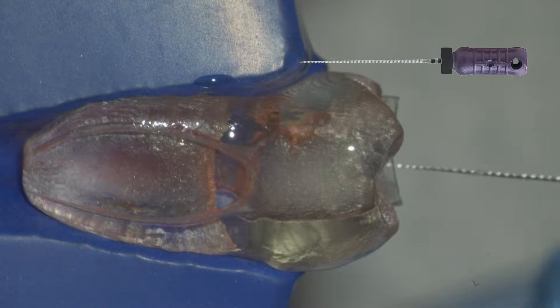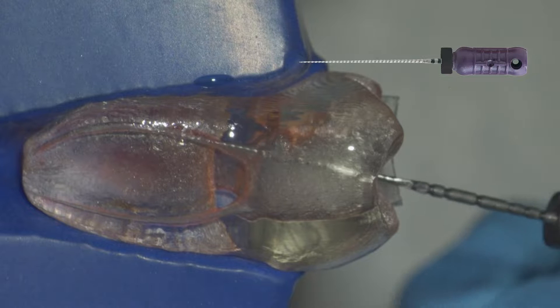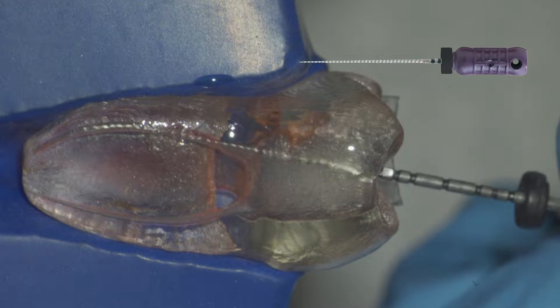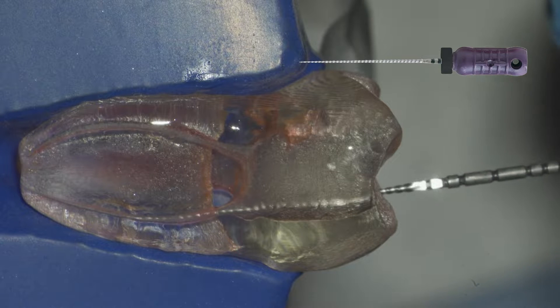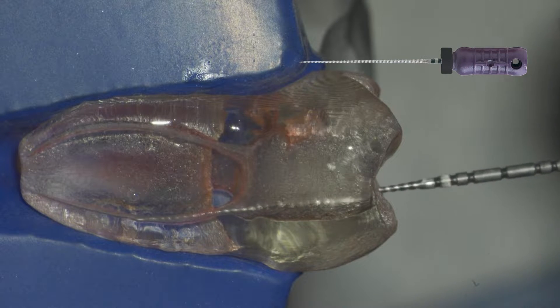Let's go over that quickly. We scout with our hand file using a viscous chelator. One of the key things to remember when using a hand file is it's a good idea to use a viscous chelator. Once this is accomplished, you want to make sure you rinse the chamber and irrigate the canal.